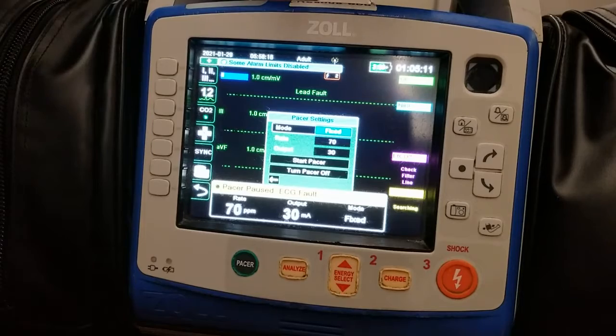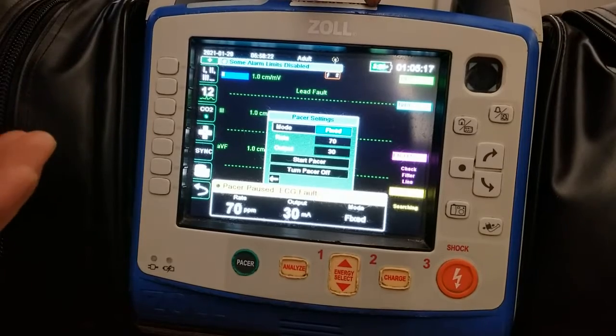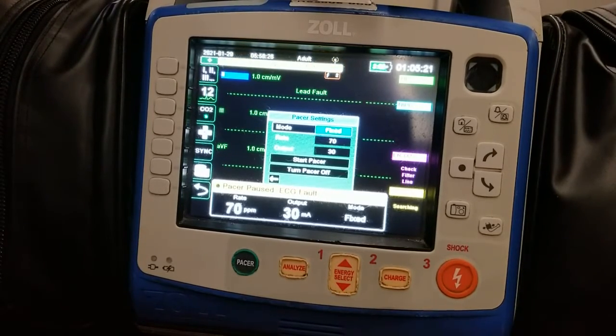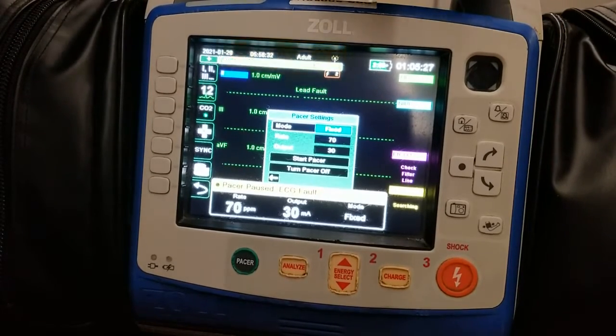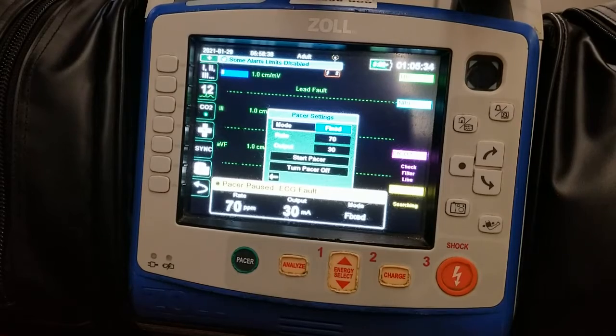If the patient becomes conscious again because of the pacing, their heart tries to take over. If the monitor is on demand mode, then it would turn off, and the patient ends up passing out again, so let's just keep it on fixed. This is not going to be comfortable for the patient, but they are passing out at this point. We can also consider sedation, and this may be something where we start the monitor, get them going, and then we offer sedation after we get it going.